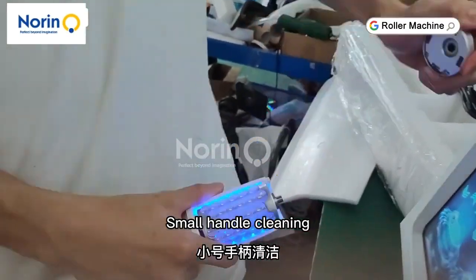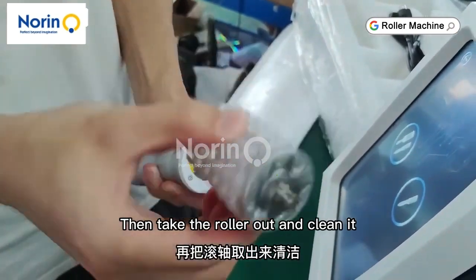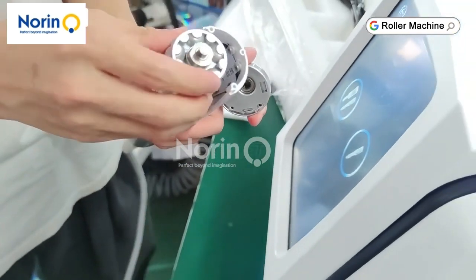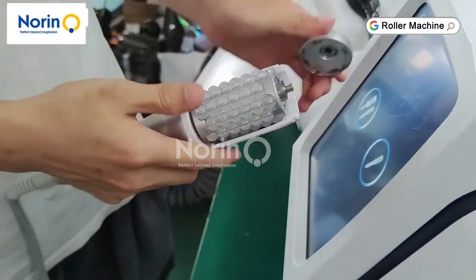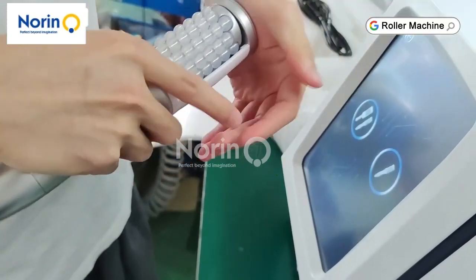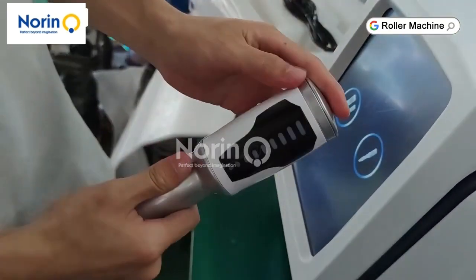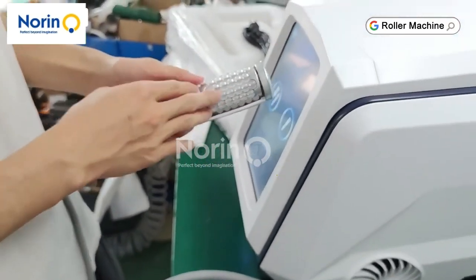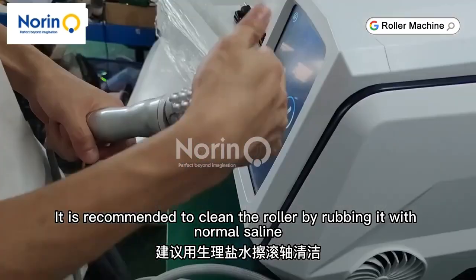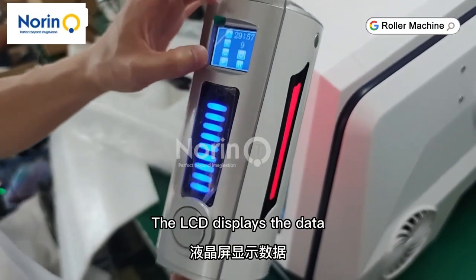Small handle cleaning: take the lid out. Then take the roller out and clean it. Align the slot and put it back in. Put the cover on again. There is no gap in the assembled state. It is recommended to clean the roller by rubbing it with normal saline solution. You don't need to open it often to clean it.